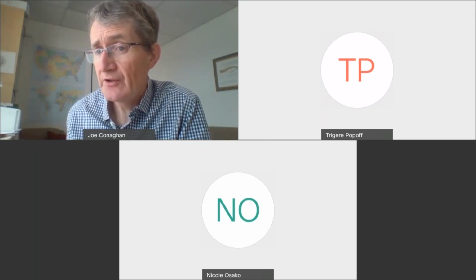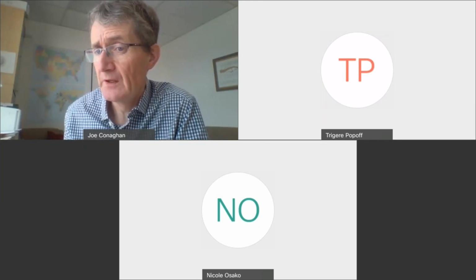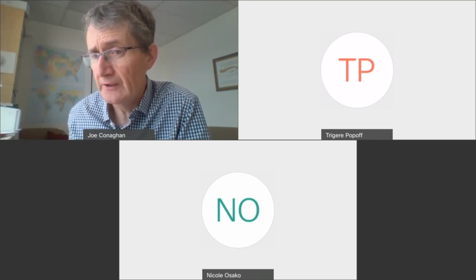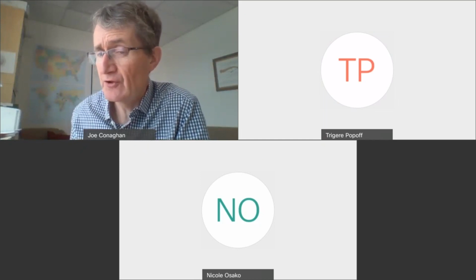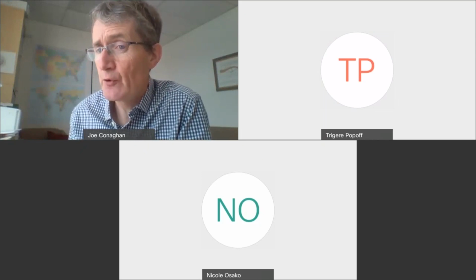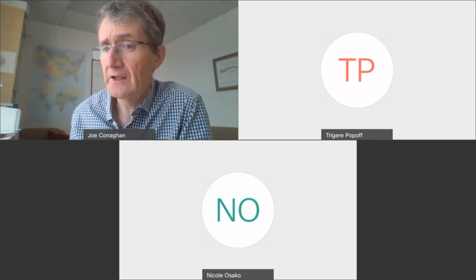Now, as I pointed out in the talk, cells are extremely stable when they're in that sort of shrunken condition, when they've lost their water and they've gone down to about 30 or 40% of their initial volume. In the VS, you do not need for them to re-expand. Once they've fully shrunken and they're washed through the vitrification solution, so there's no trace of the previous solution anymore, they are ready to go in the liquid nitrogen. There's no need to wait. The longer you leave them in there, it's just unnecessary exposure to high levels of cryoprotectants that they don't need. Get them onto your device, get them into the liquid nitrogen, and get them vitrified.